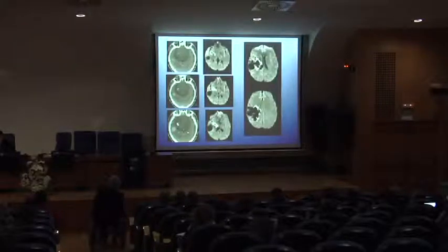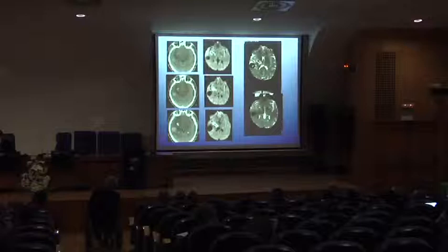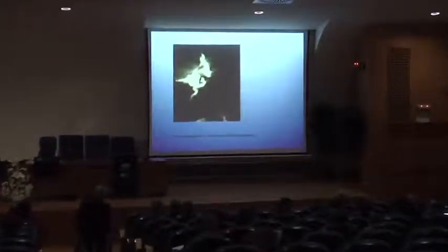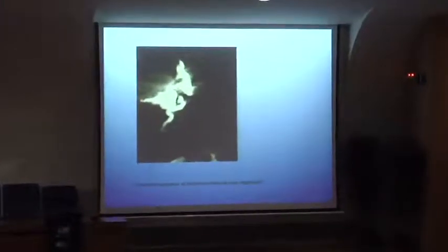But the patient had a deficit because of reflux of the onyx in the initial part of the lenticular artery. Next. You know, this is the cast, and this is, in our opinion, the lesion of the internal capsule, because it's impossible to see the reflux of the onyx with the technique. In this position, normally I prefer to use NBCA.